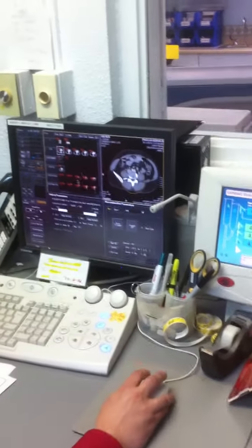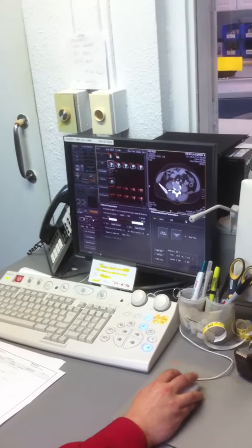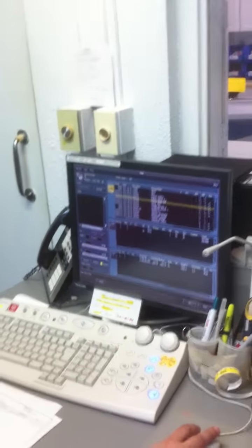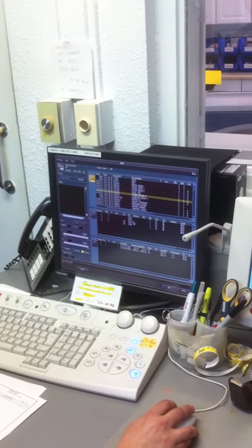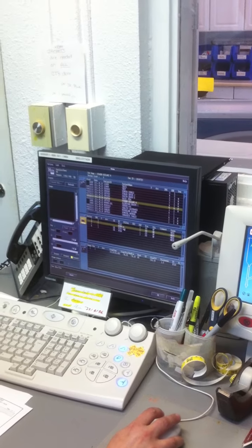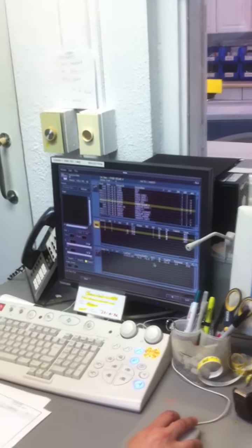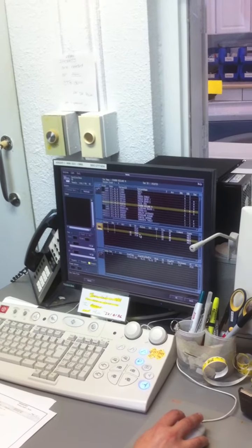Oh, I know. I'm going to take a quick divergence here and show you guys play in reverse. In play in reverse, we can actually play back our real-time scan. So who is the one with the carotid? Yes. Now, you guys all know that that's scouts. This is your Sure Start line. Look at the DY mode, dynamic mode. Scanning a bunch of times without any table movement, that's what a dynamic scan is. So I'm going to hit OK.